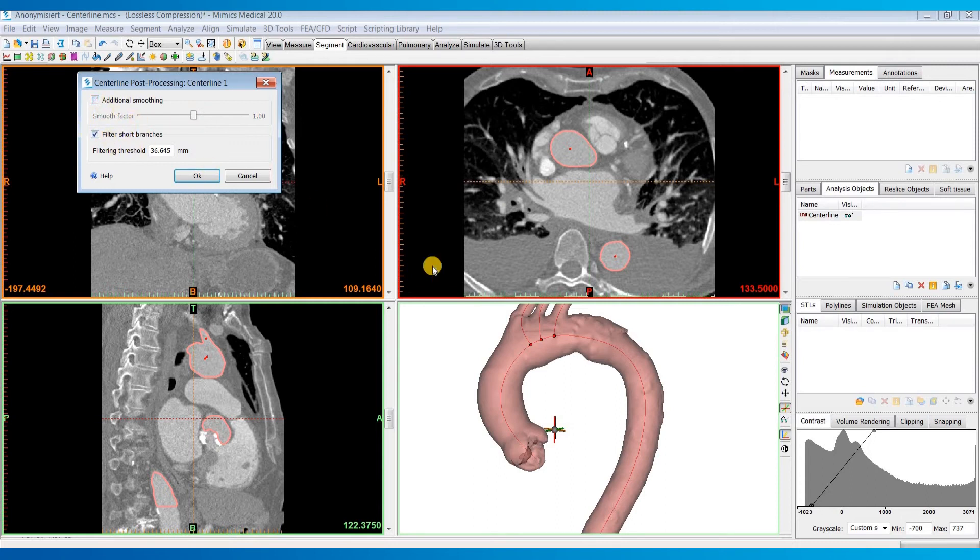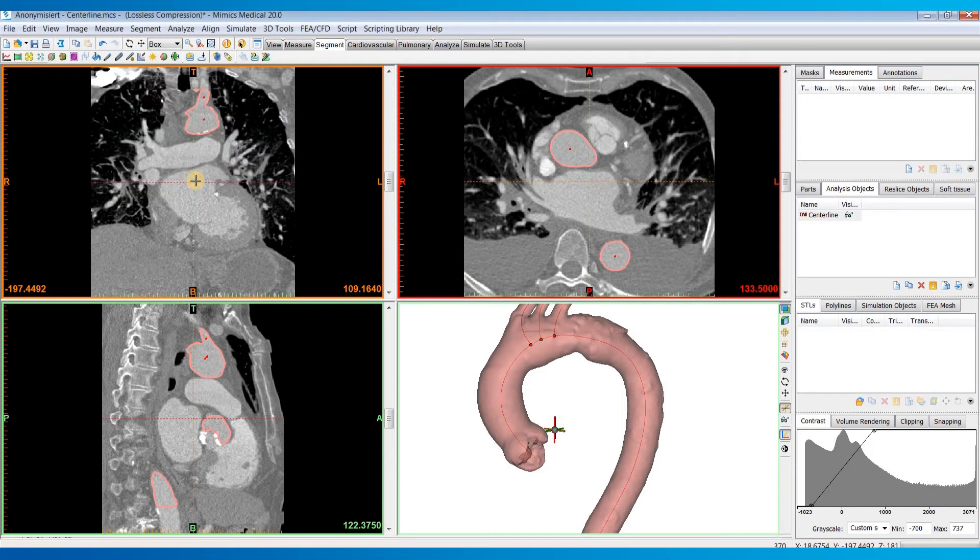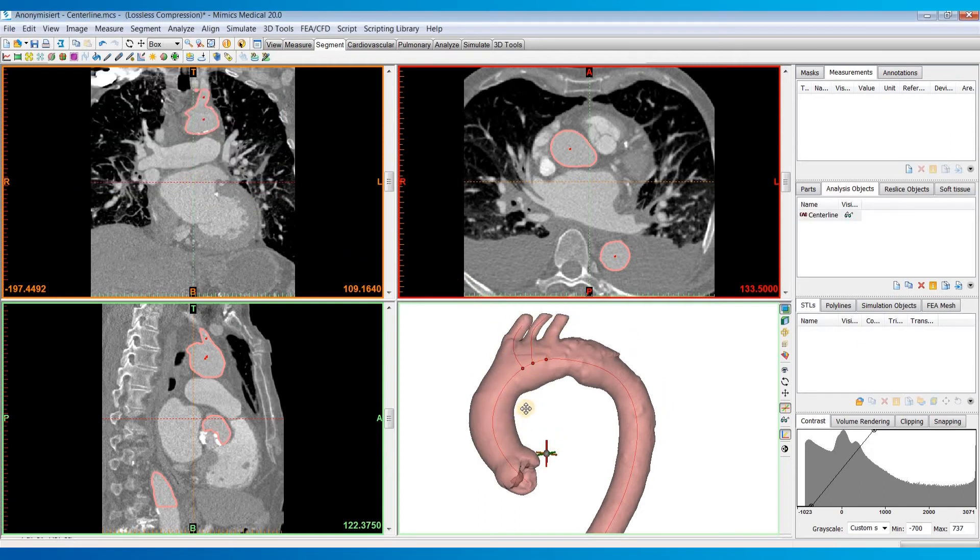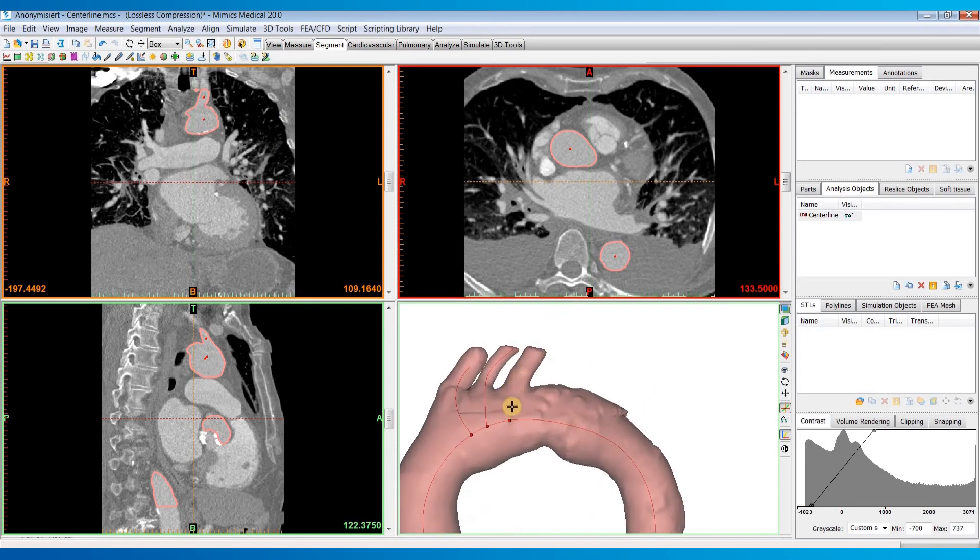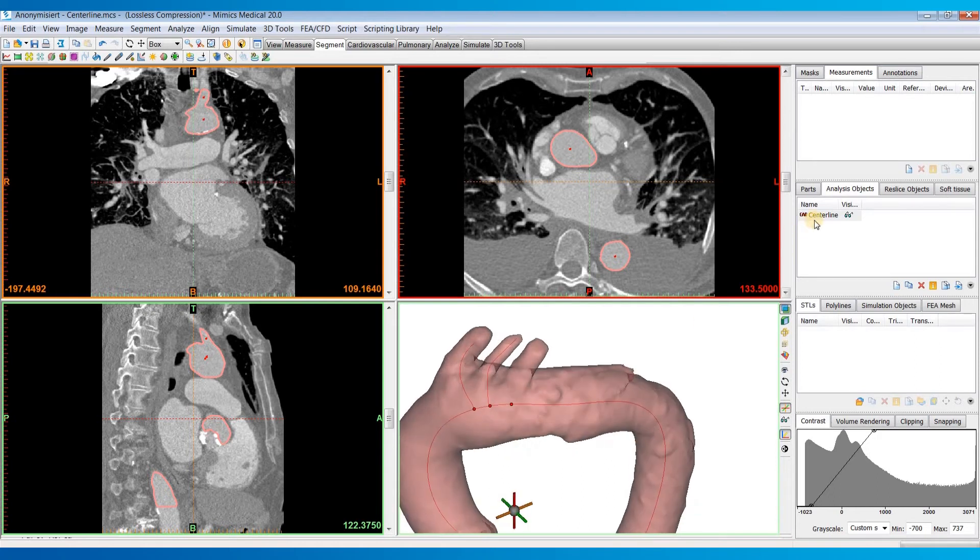I'll show you that. So it looks like it calculated some of the branches for the arch vessels. If I hit OK, you can see one of those must have been smaller than that distance that was set. So it deleted that.